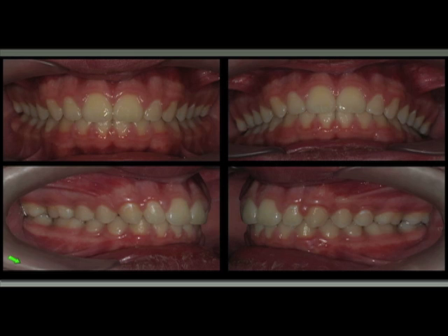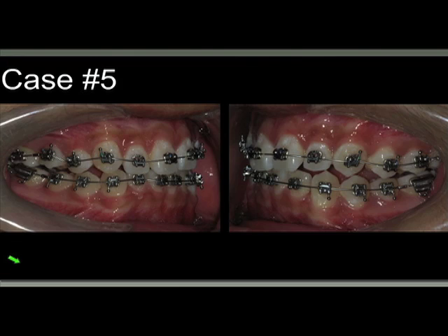So you can see the consistency. The next case is basically just the opposite. It's more like a class 3 malocclusion, where you can see the first wire. We treat this case with some interproximal reduction and class 3 mechanics, specifically on the left side.